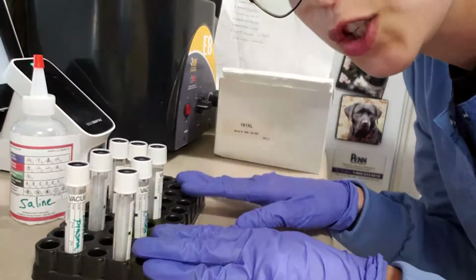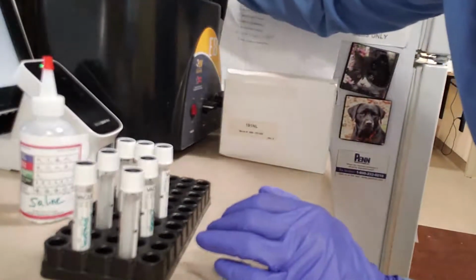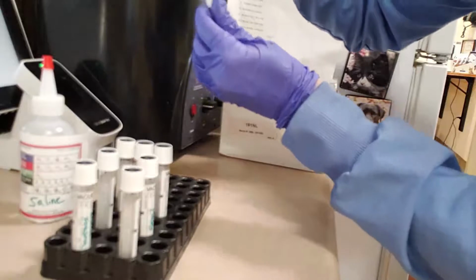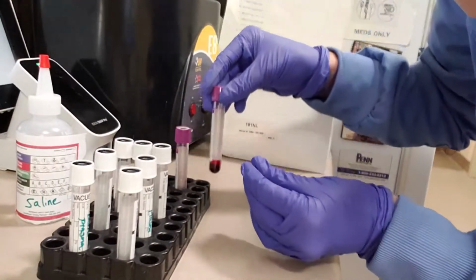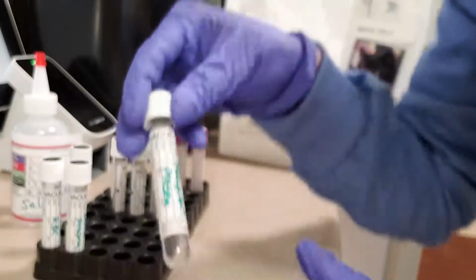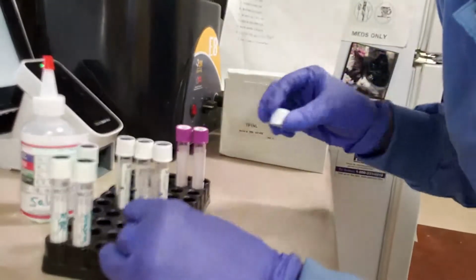Okay, so we have our tubes ready, and we have our plasma and our red blood cells. Gabby's plasma is a bit lipemic, so we will collect our plasma first before we get to our red blood cells. So we have our recipient plasma tube.